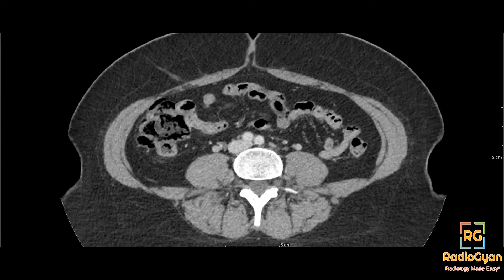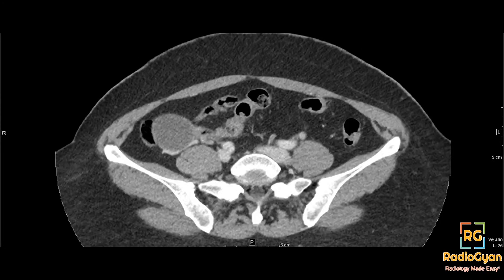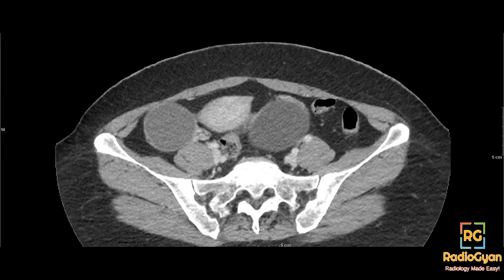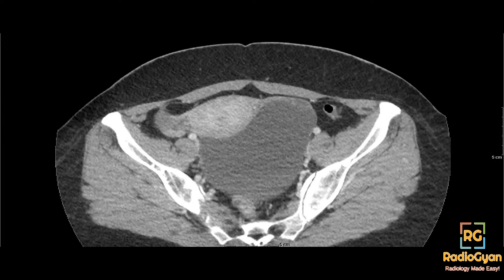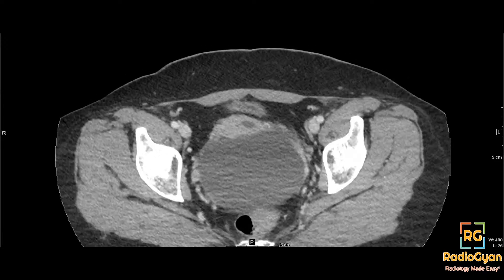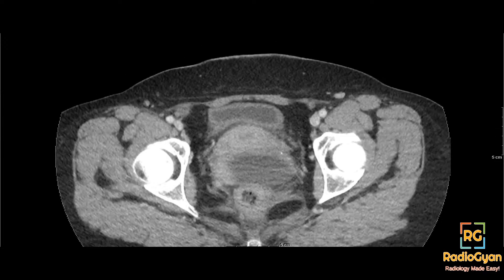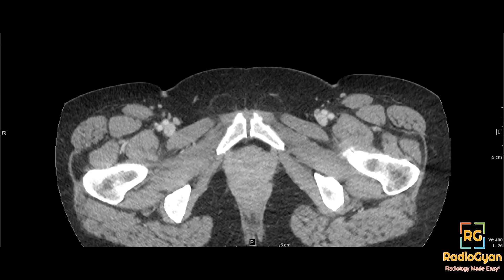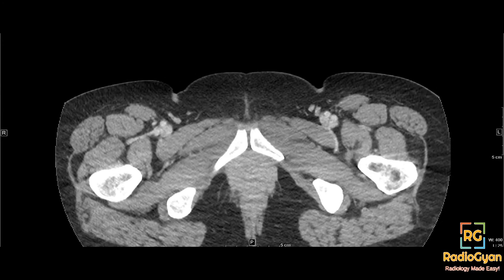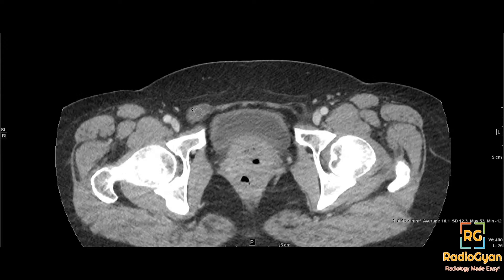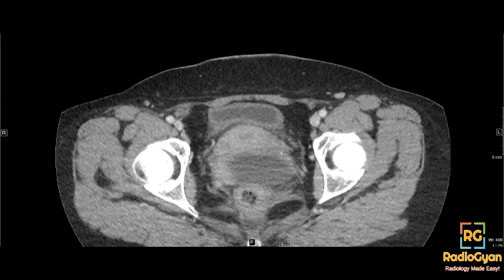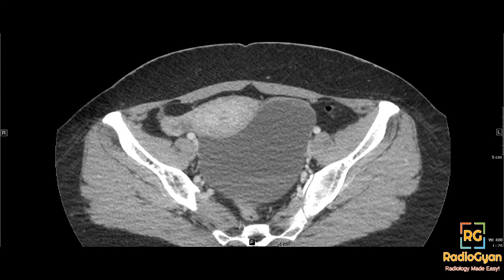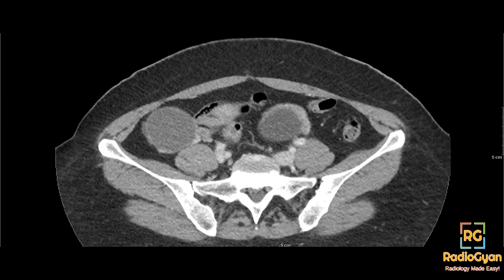What we saw here were bilateral adnexal cystic lesions, and apart from that we saw something else. The adnexal findings are not the finding I'm trying to show. If there's anything else that catches your eye, let me know. I do also have an MRI for this patient.